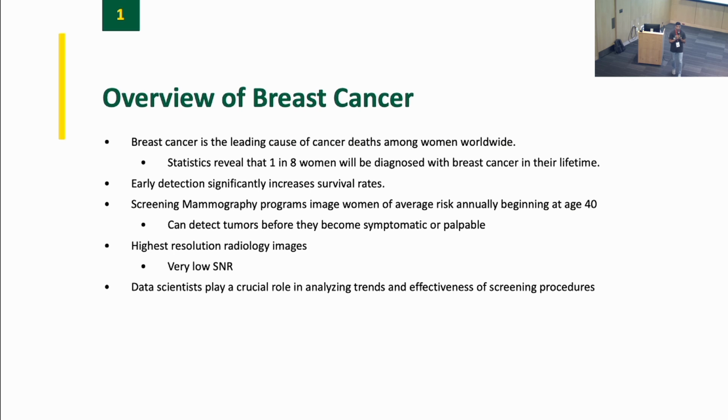So you have a true needle in the haystack problem where you have to detect something really tiny that's really rare on a really high resolution image. Okay, this is what makes this very challenging, but also very valuable and interesting. And this is why we wanted to leverage this data set during this datathon, because as data scientists, if you guys understand how breast imaging works, then you can help to design the data engineering and design the models that go into training to detecting cancer.